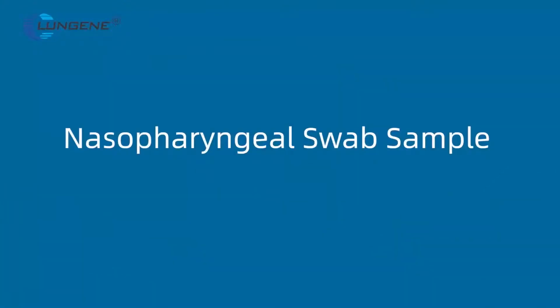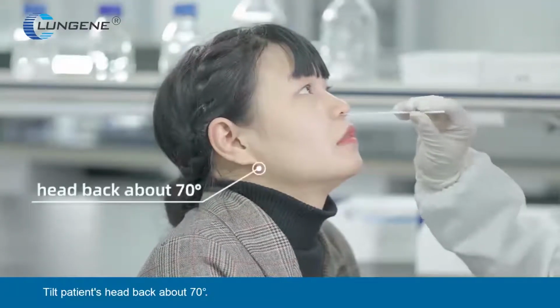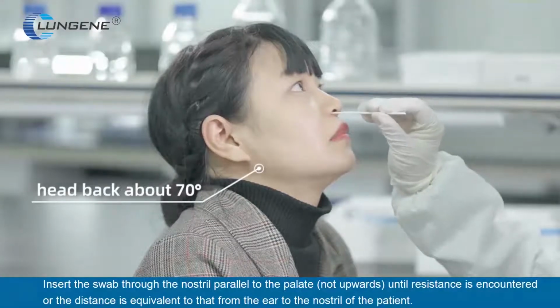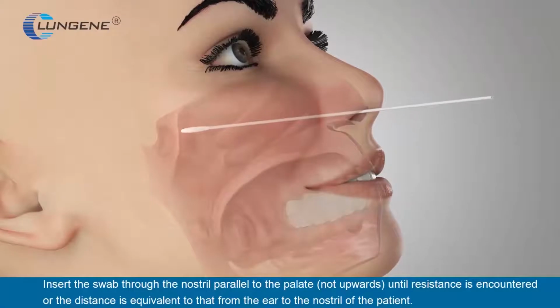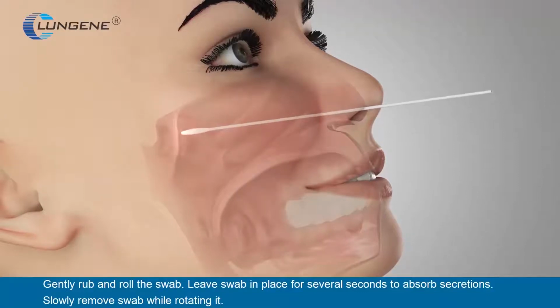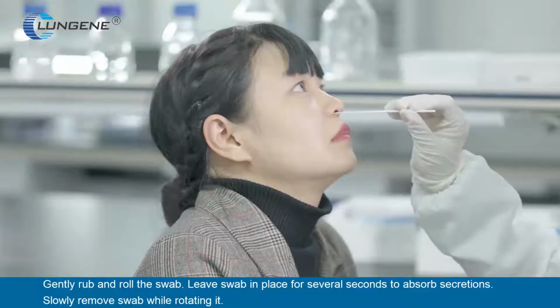Nasopharyngeal swab sample. Tilt patient's head back about 70 degrees. Insert the swab through the nostril parallel to the palate, not upwards, until resistance is encountered or the distance is equivalent to that from the ear to the nostril of the patient. Gently rub and roll the swab. Leave swab in place for several seconds to absorb secretions. Slowly remove swab while rotating it.